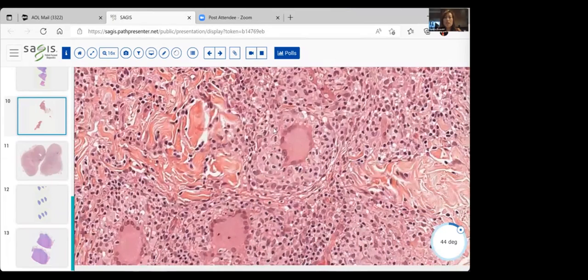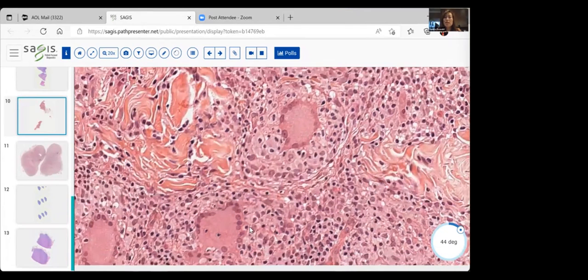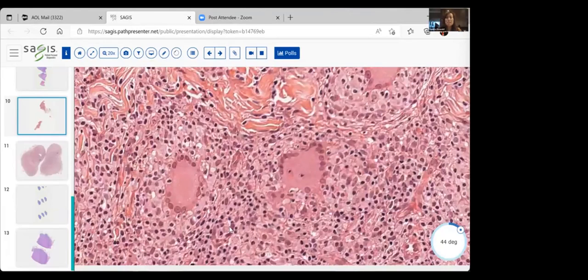And you have these giant multinucleate cells. Sometimes you have 50, 60 nuclei in some of these multinucleate giant cells. Now, I looked very carefully and I couldn't see it, but in this condition, these multinucleate giant cells are not only trying to eat up these atypical lymphocytes, right? So you do see the lymphocytes within the cytoplasm of this multinucleate giant cell.